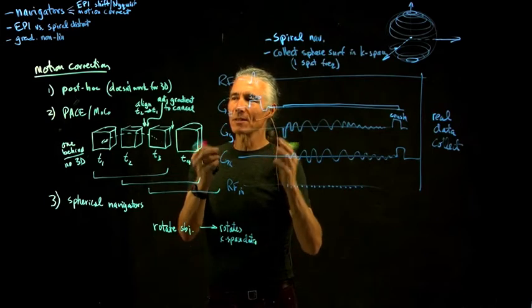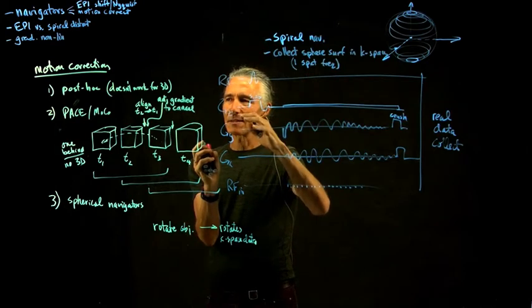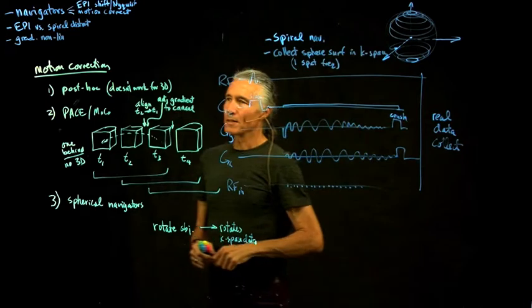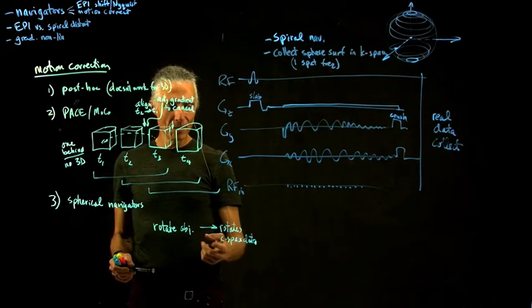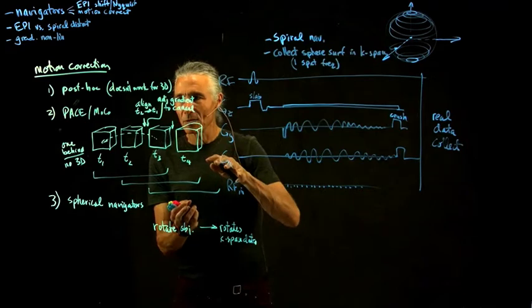So you can see this in MATLAB. You can just take K-space data, rotate it. You've got to figure out how to rotate all the data. That's a little tricky. But if you do that and then do the reconstruction, you'll see that will just rotate the image. So nothing fancy there. A rotation in real space equals a rotation in spatial frequency space. That sort of makes sense because you're just kind of rotating the stripe patterns.